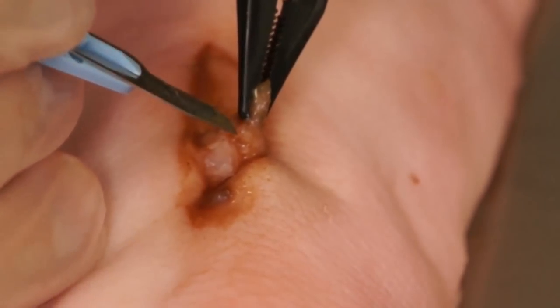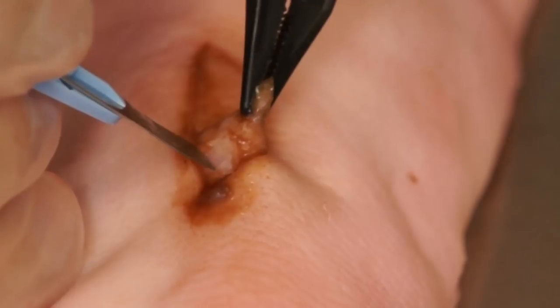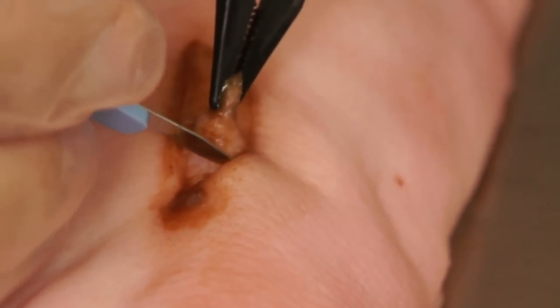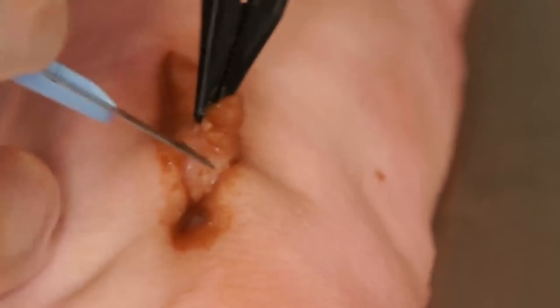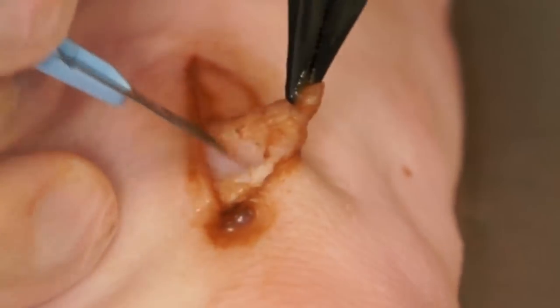Once the majority of necrotic tissue has been removed, one can use the edge of the scalpel or dermal curette to remove any remaining necrotic tissue that may be present between the interface of the normal tissue and the necrotic tissue that has been removed.